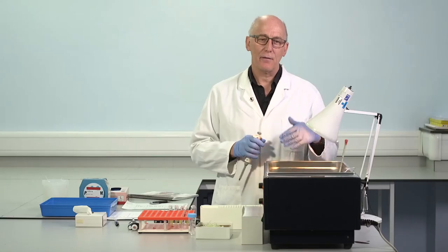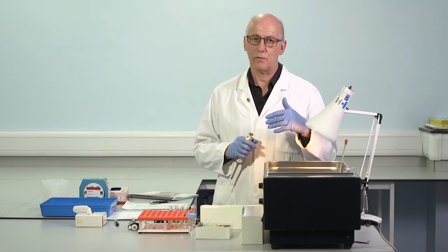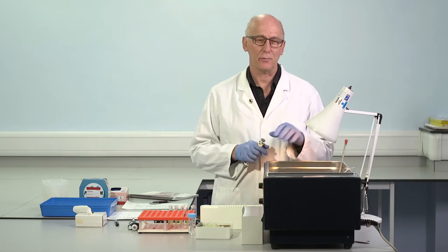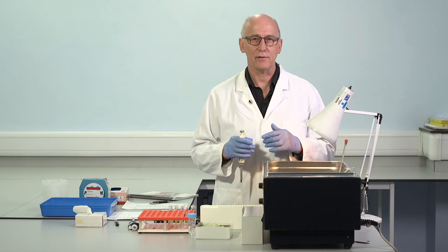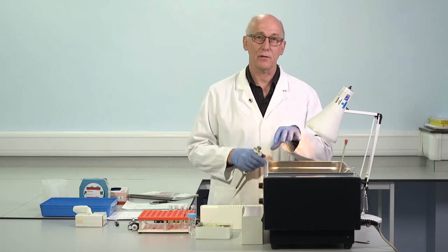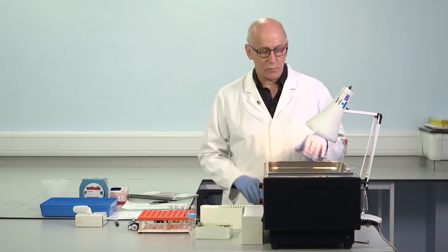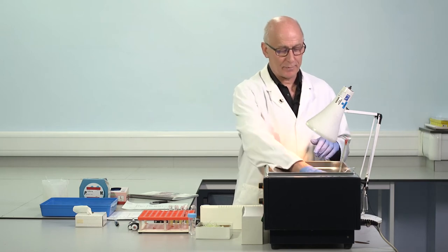If this sample is left for an extended period before testing, then there is the potential for change in the clotting factors present in the tube. So we don't want to leave these in at 37 for 15, 20, 30 minutes. We need this to be in 1 to 2 minutes, come to temperature, make the test. At the moment, nothing's happening in the test tube, simply warming up to temperature. But we're about to add the APTT reagent.